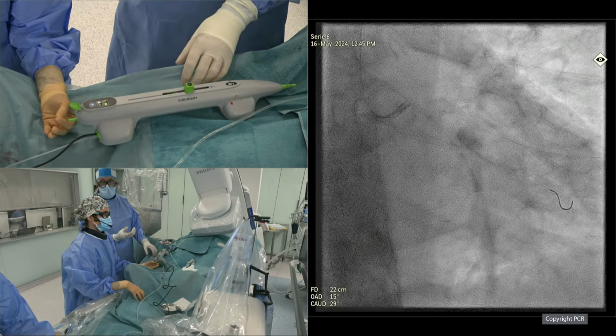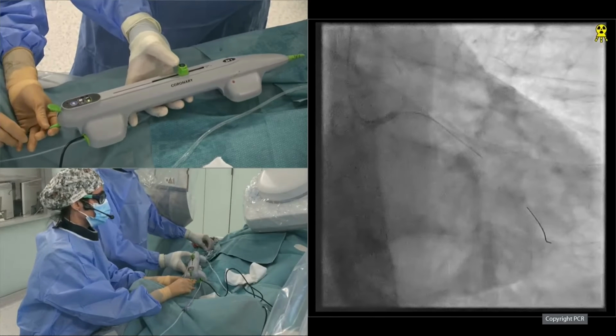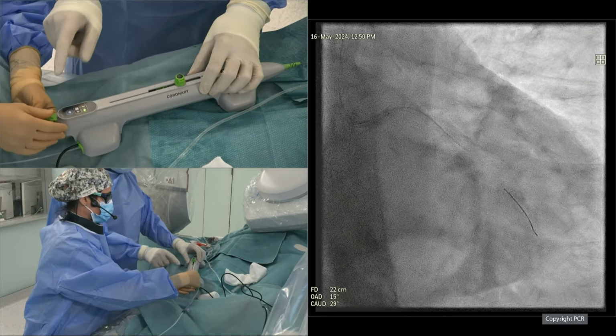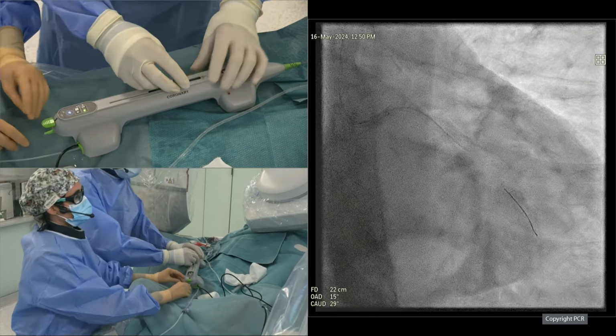It went already much more easily. You saw? Okay, so we go now for another ablation. We put the brake on. I'm going to make it with cine so you can see how it's moving. Look at the speed. No pecking movement. Sometimes you see these small jumps, and then you release the tension. And you will continue with fluoro so we don't give additional radiation.